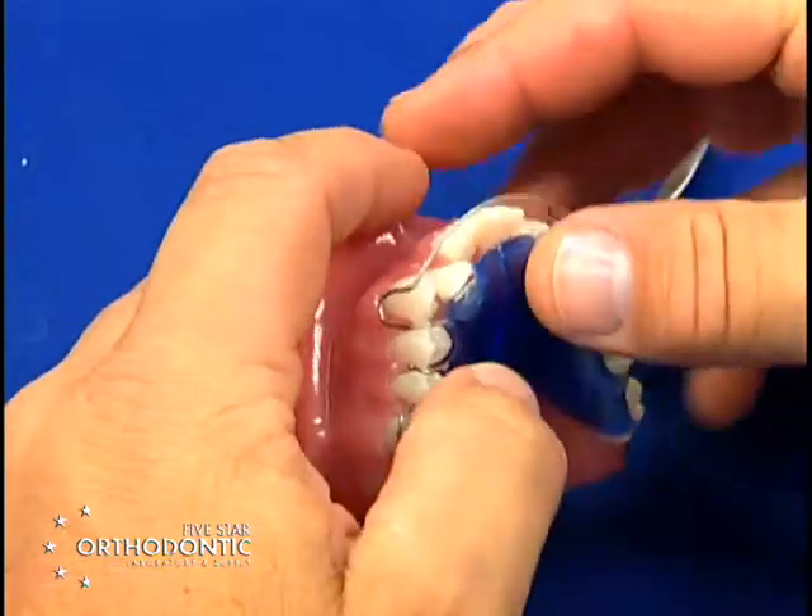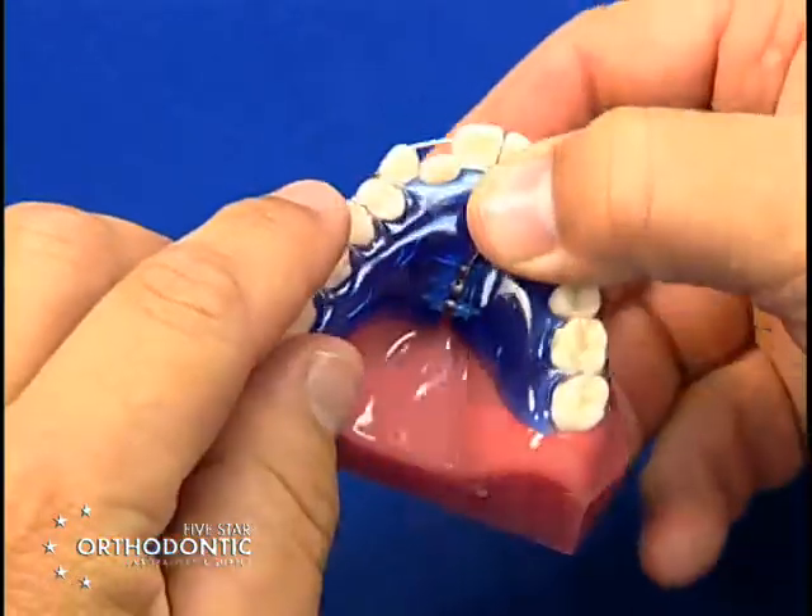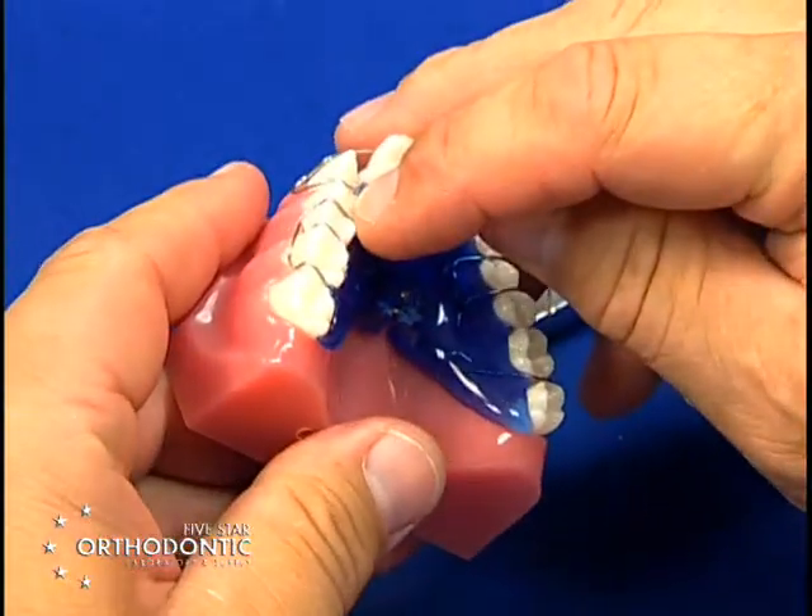So there are just three little bends to activate the ball clasp, which brings the ball clasp back into the interproximal and sits smoothly across the occlusion.